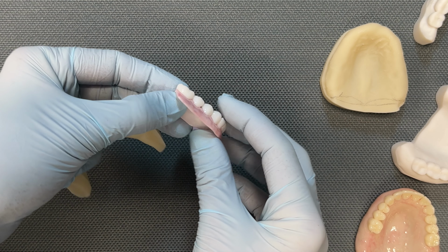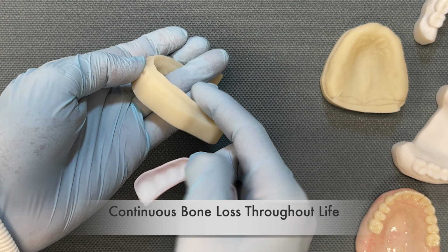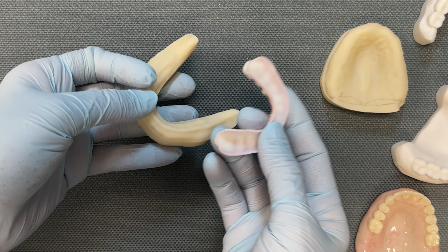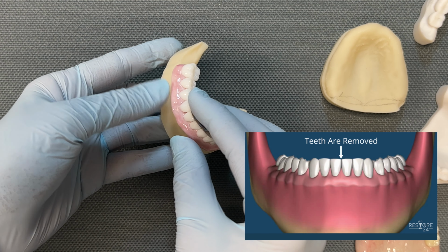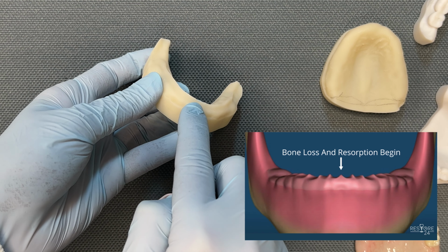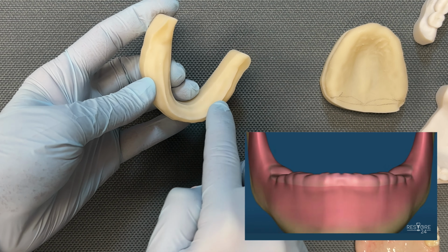In some of the other videos, I've explained to you how a denture has this ridge lap. It just kind of sits over. Well, eventually, you're going to have to reline this, right? The bone continually resorbs. It goes away. And then at some point, when this is what we call knife-edged, which is kind of what they've tried to replicate here, just so you can have an idea of it, there's really nowhere for this thing to sit.